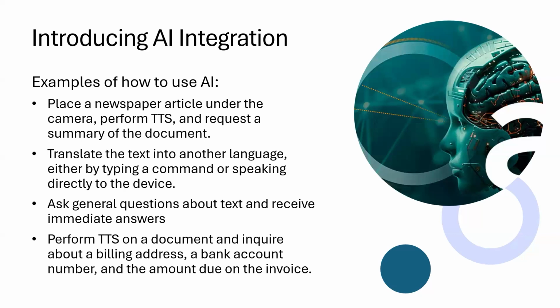And even when you get the size and the color and everything that you want, which makes it easier, there can still be some fatigue or eye strain if you're doing that for school or for a job and you're utilizing your vision to do that for a long period of time. So that's a really neat feature. You also can translate the text into another language. So you could say, translate this to, for example, Swedish, and it would translate that text. You can ask general questions about the document.